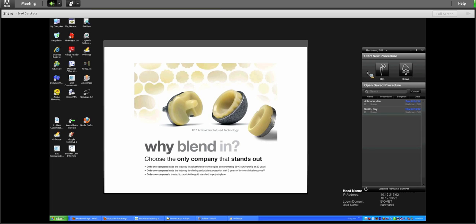So you will have set up with you a list of your surgeons, and the surgeons vice versa with their sales reps. So when this opening screen comes up here on the right, you would see populated the people who are associated with you and with you only. So it's not like you're going to be able to see everybody in the entire Biomet network. This would be relative to your accounts.